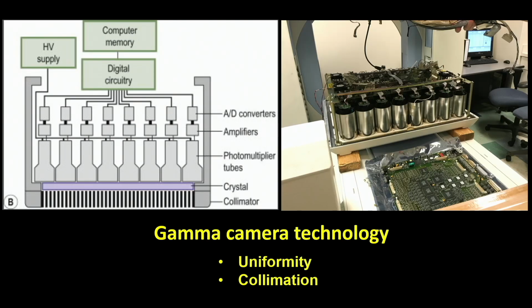So again, going back in time, you're looking at the technology we use, the gamma camera technology. You have these round photomultiplier tubes, you have the collimator, and then the crystal for detection, and then the technology to interpolate and localize where the events occur. And this is when you take that apart. And now there's newer solid state versions of this. So instead of these PMTs, they're these solid state detectors. So it's very similar to our old CRT televisions that used to be so big, and now with HD TV, solid state, pixels. So kind of think of it like that.